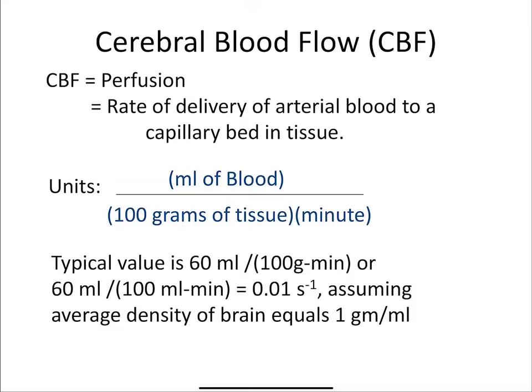So that's very important. That also sets a limit on why ASL is a very low SNR method, because from a volume of brain tissue, only 1% of that signal is going to be fresh blood, and that's what we're trying to measure. That's why ASL is a very challenging method, because we're trying to measure that very tiny signal.